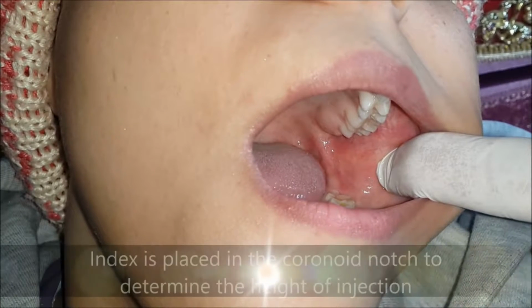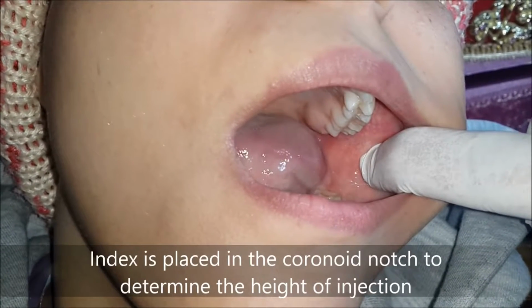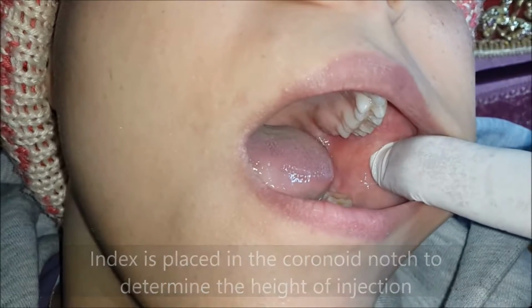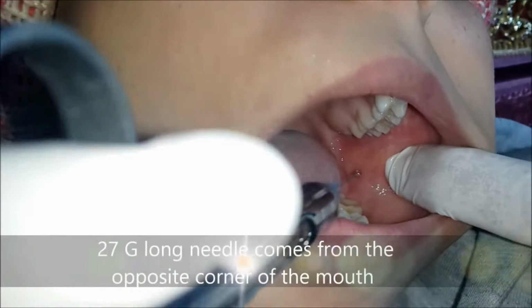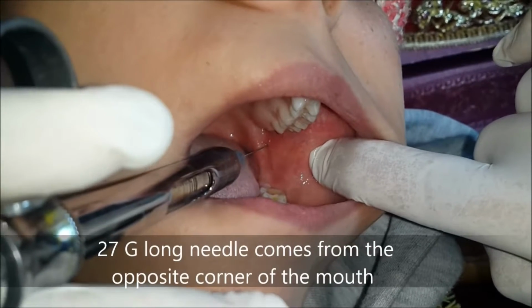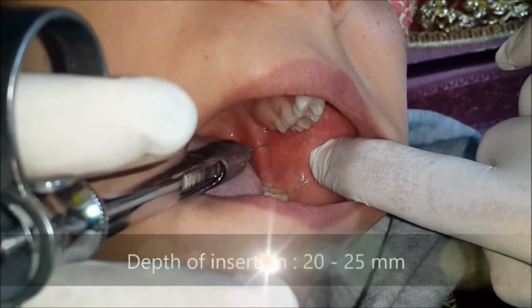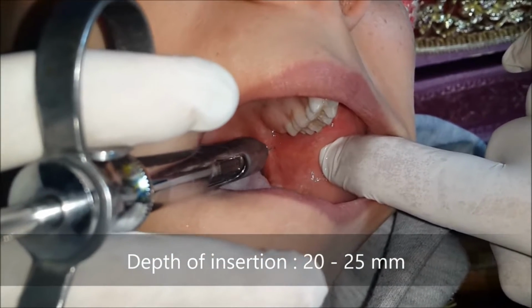Here is a live block demonstration. The index finger of the non-dominant hand is rested in the coronoid notch of the anterior ramus of the mandible. The needle comes from the contralateral side, from the corner of the mouth, and it is inserted into the pterygomandibular depression and advanced for 20 to 25 millimeters until bone is contacted.